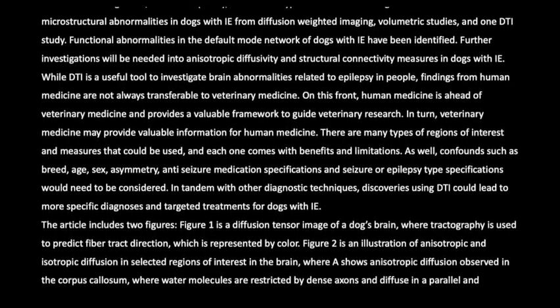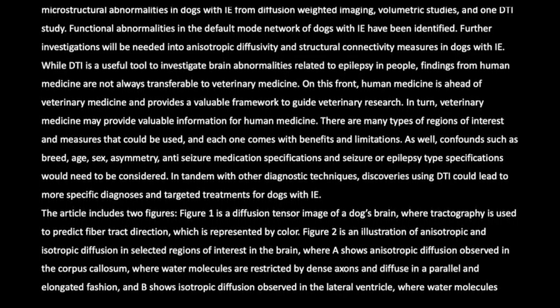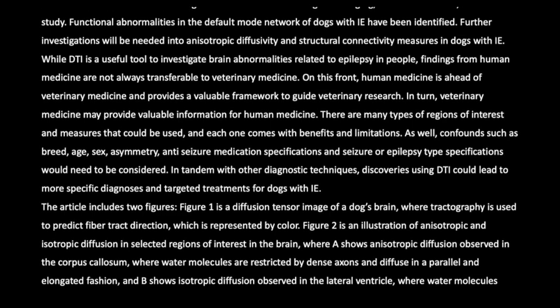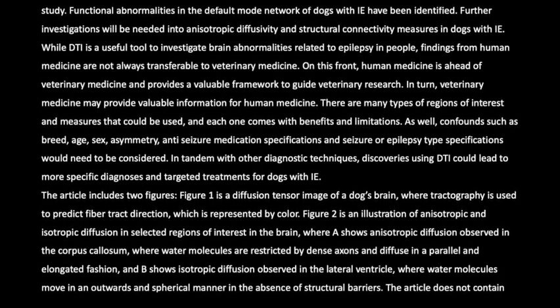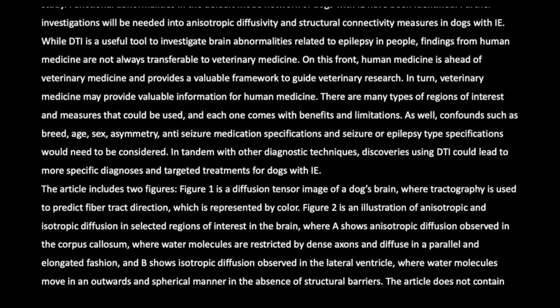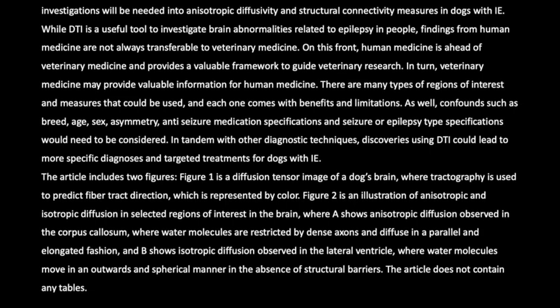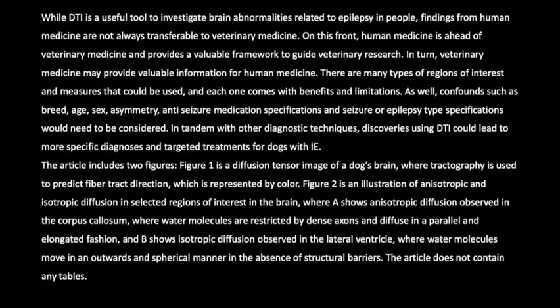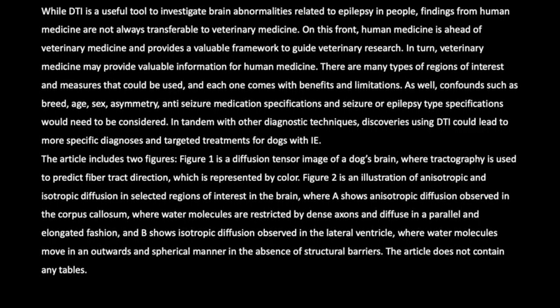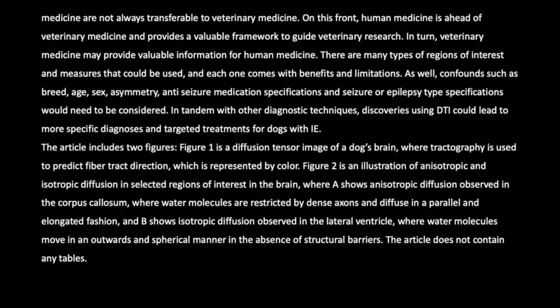There are many types of regions of interest and measures that could be used, and each one comes with benefits and limitations. As well, confounds such as breed, age, sex, asymmetry, anti-seizure medication specifications and seizure or epilepsy type specifications would need to be considered. In tandem with other diagnostic techniques, discoveries using DTI could lead to more specific diagnoses and targeted treatments for dogs with IE. The article includes two figures.